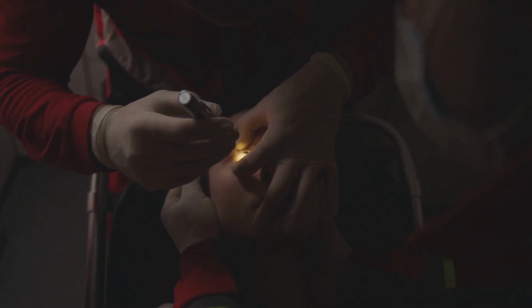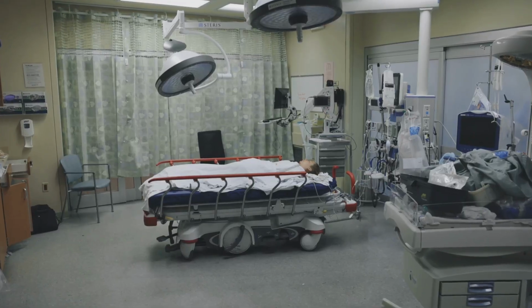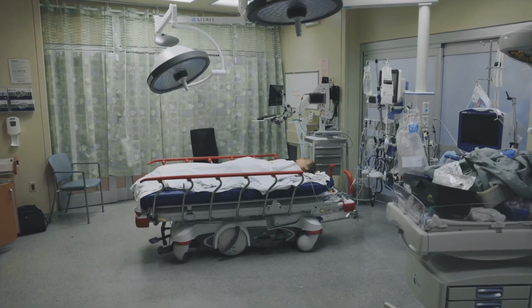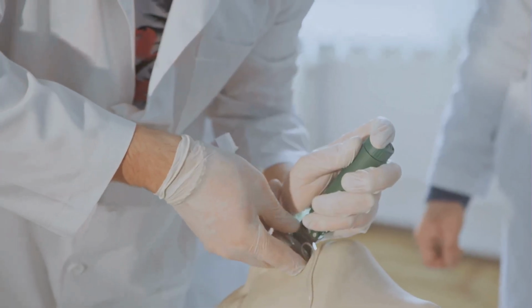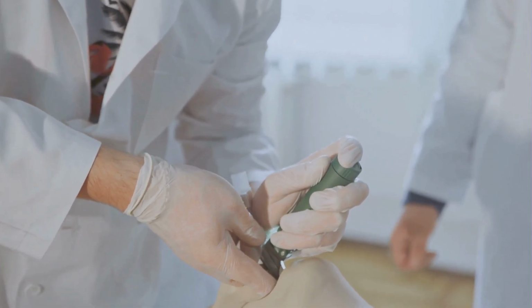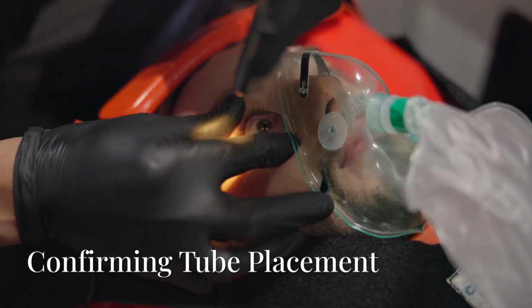If basic measures are inadequate and the patient cannot maintain their airway or is unconscious with a GCS less than 8, consider advanced airway placement. This may include endotracheal intubation or supraglottic airways, for example, King LT, iGel, LMA.